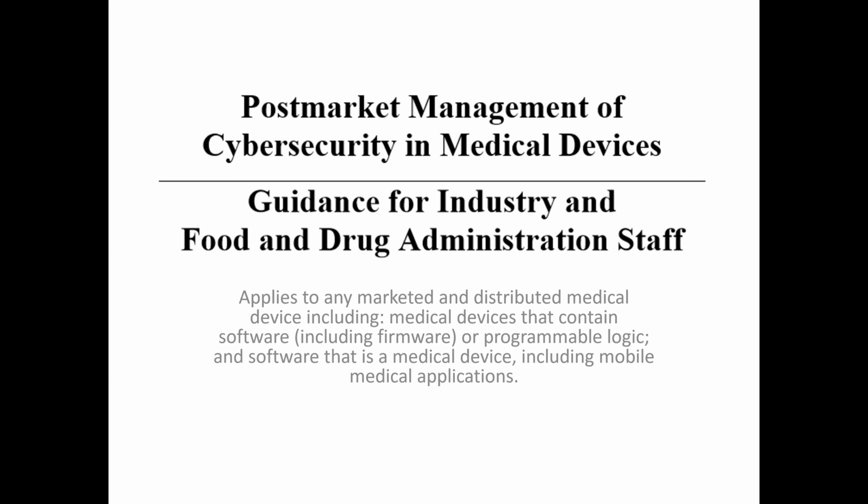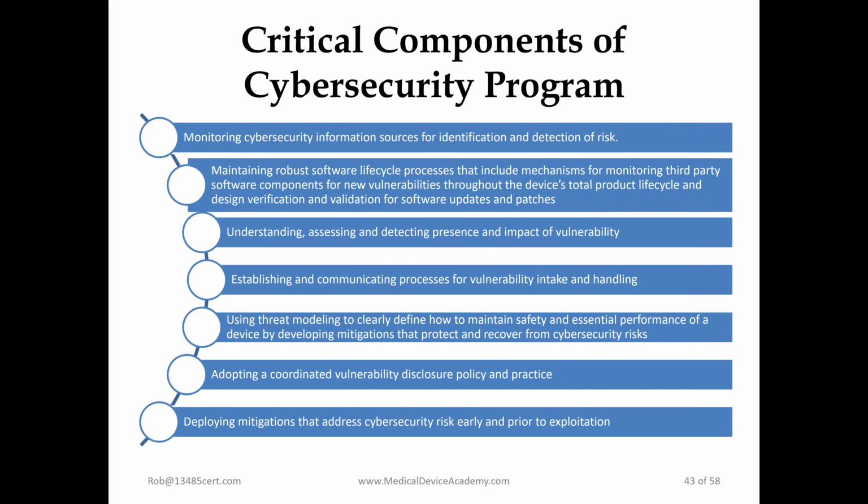So with regard to post-market management of cybersecurity, you're going to see some of the same techniques recommended. If we could go to the next slide. So these are obviously going to be items that apply to devices that have already been cleared or marketed. So they want to see a cybersecurity program, a documented process that shows that you're monitoring cybersecurity information, you're maintaining a robust software lifecycle process, and you're establishing and communicating vulnerabilities, and handling them appropriately. Next slide, please.